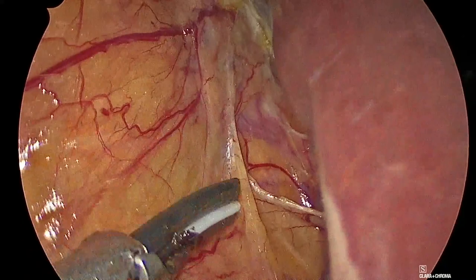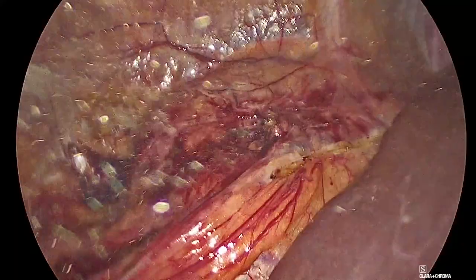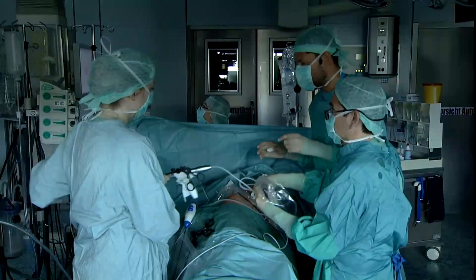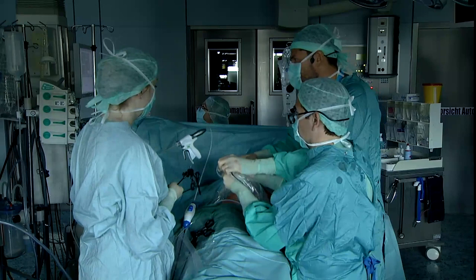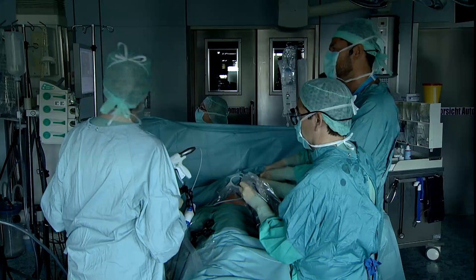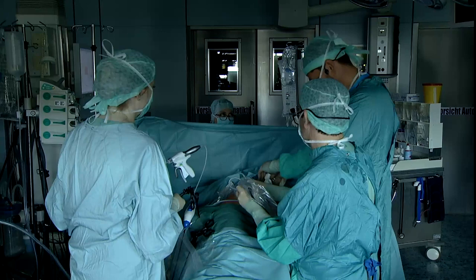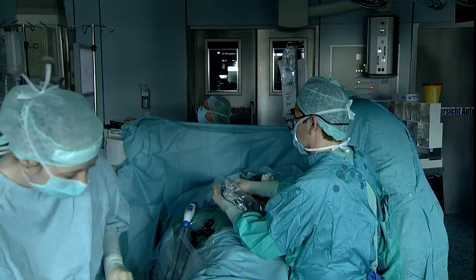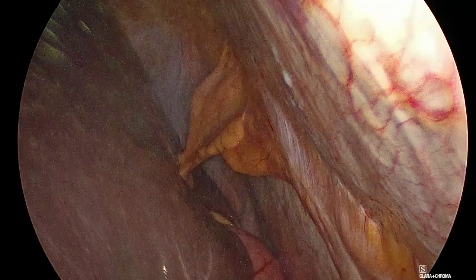So you see the adrenal gland here. The reason why I dissected the triangular ligament of the liver is because now we will do a maneuver that you are all familiar with, lifting the liver up. You see here the gallbladder and liver, and once we have the liver lifted up, I think we will have a much better vision. Okay, so let me have another joker. We want to go as high as possible. That's why I marked the xiphoid. And at this level, we just insert our trocar.